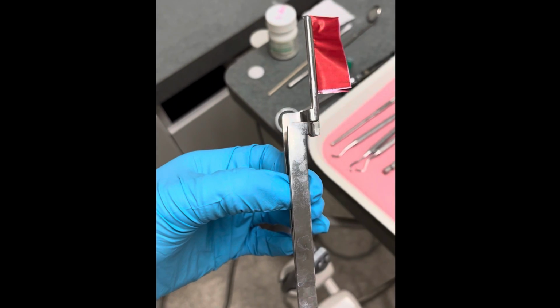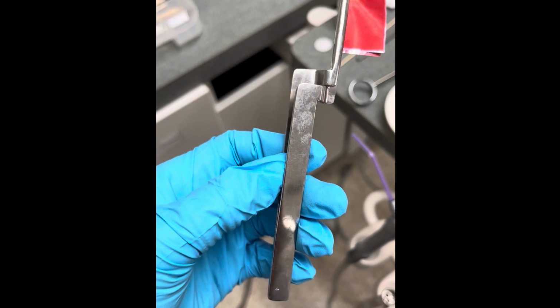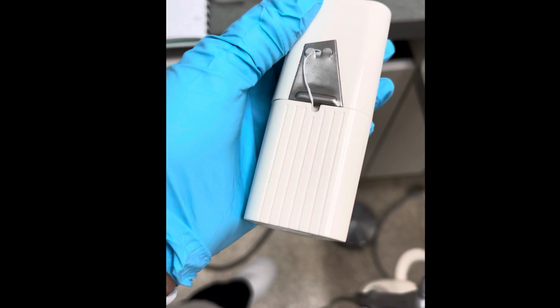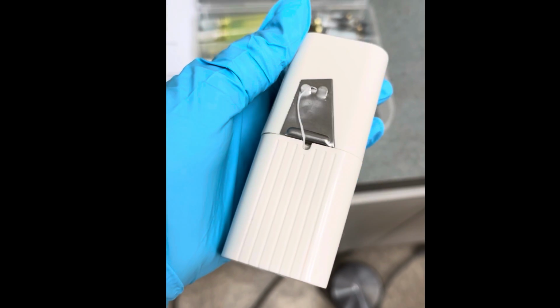Once everything is removed out of the mouth, you will then use the articulating paper holder and paper to see the bite. Once the doctor sees that the bite is even, he will then use floss to clean out the interproximal surfaces.